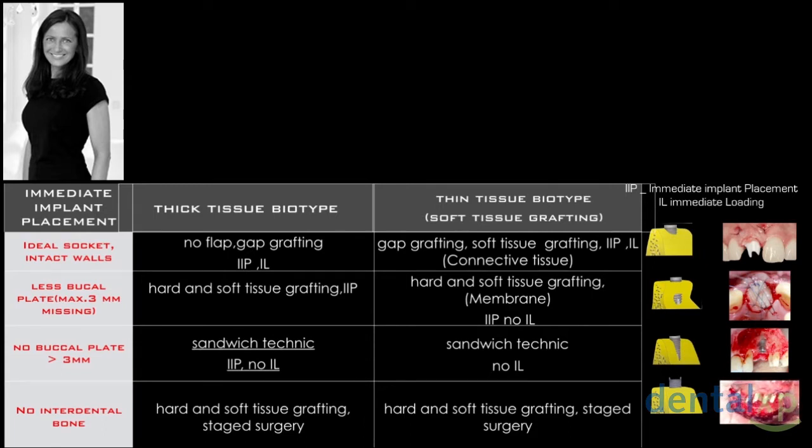In thin tissue biotype, I wouldn't, and this is a plan which was published based on my experience and literature. We don't do an immediate loading. We close the site with an onlay graft or a membrane of the new generation.